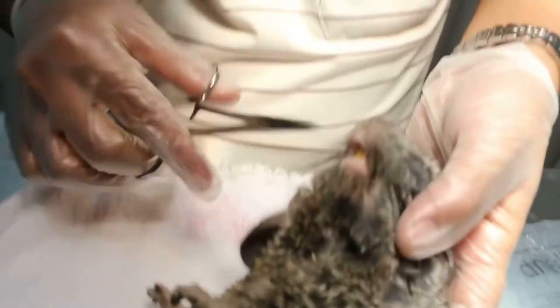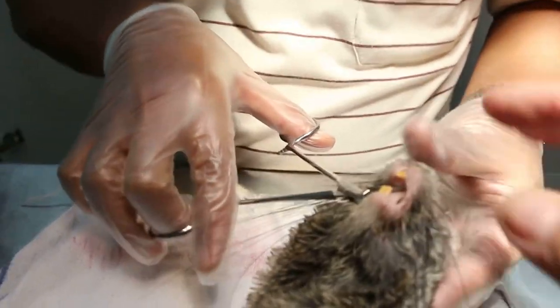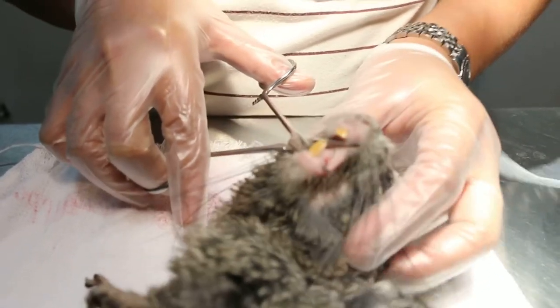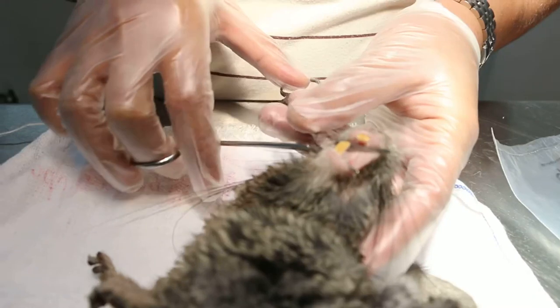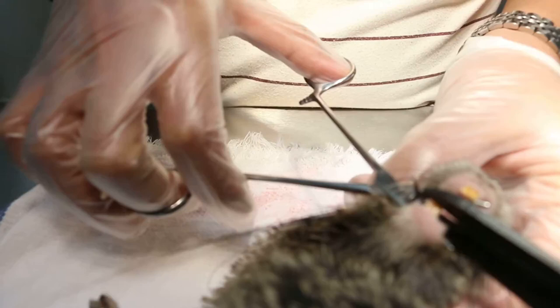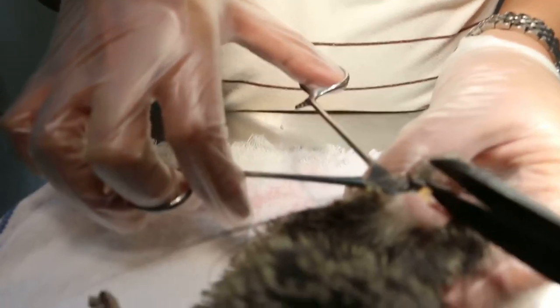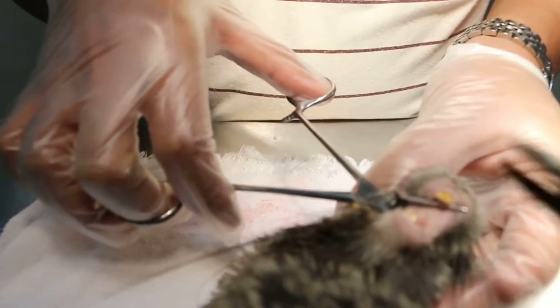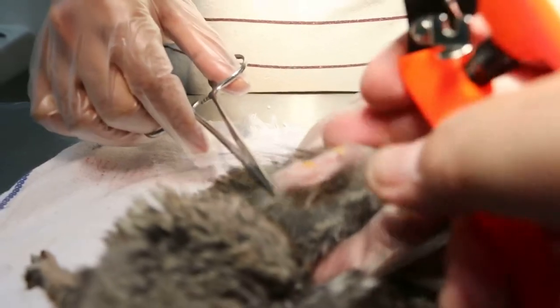Now we can see that the lower teeth is definitely longer than the upper one. So we will clip the lower teeth by about here, and the upper teeth a bit. Let go of the forceps first.